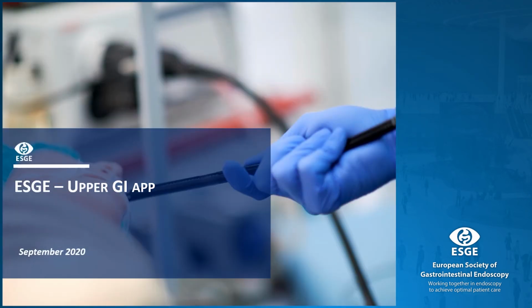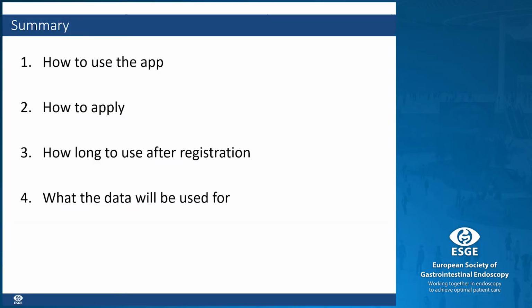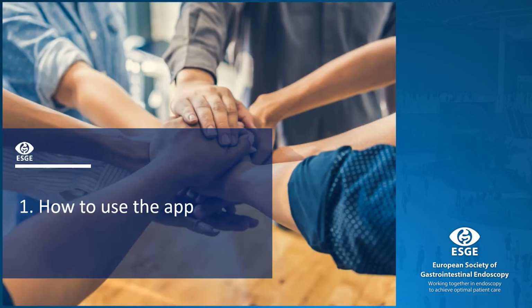Dear friends, my name is Miguel Areia and I'm a gastroenterologist from Coimbra, Portugal. And on behalf of the ESGE, I would like to welcome you to this brief presentation where we would like to show you how to use the upper GI Quality Monitoring app. In summary, I will show you how to use it, how to apply for the app, how long it will be active after registration, and how the data will be used for.